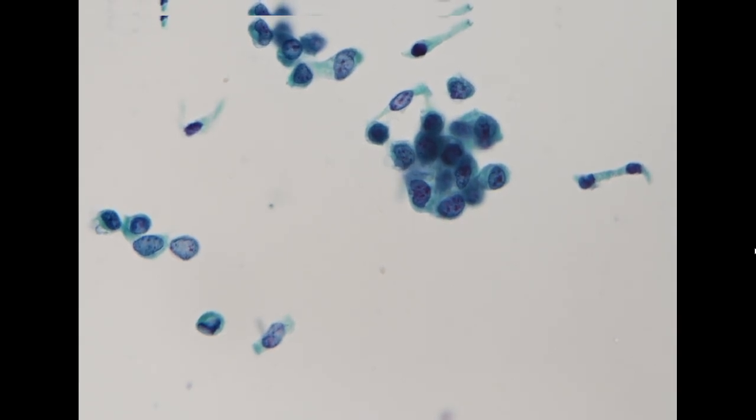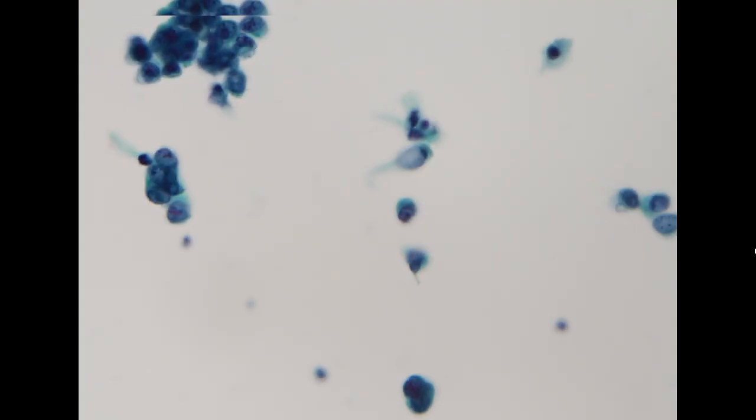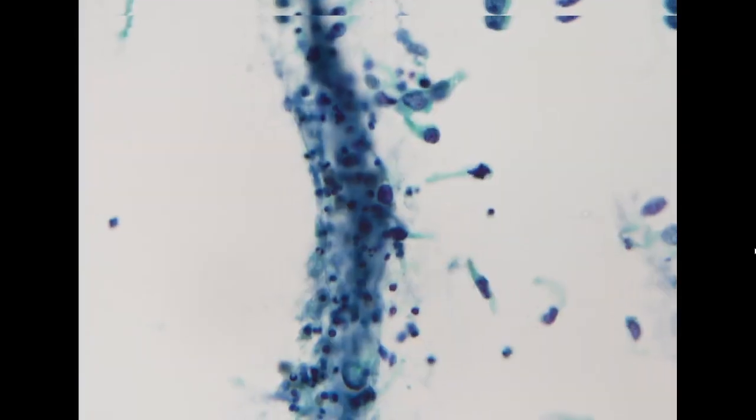Additionally, you can appreciate that the NC ratio is markedly increased. We have cells with only a very small ring of cytoplasm. So this is diagnostic for high-grade urothelial carcinoma.